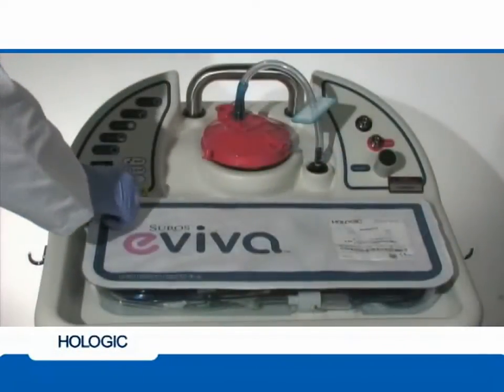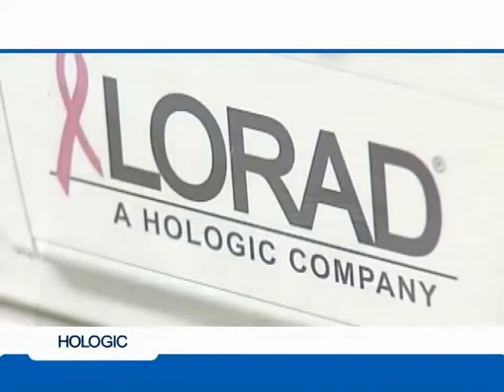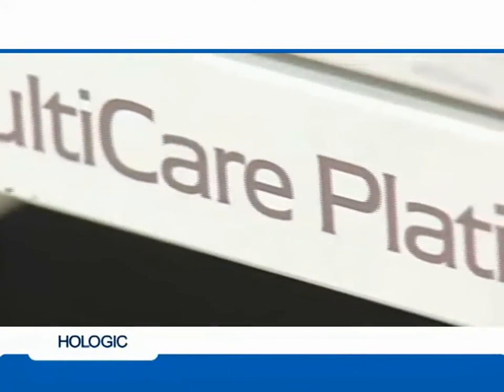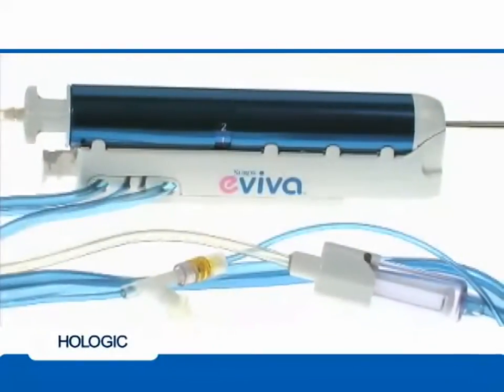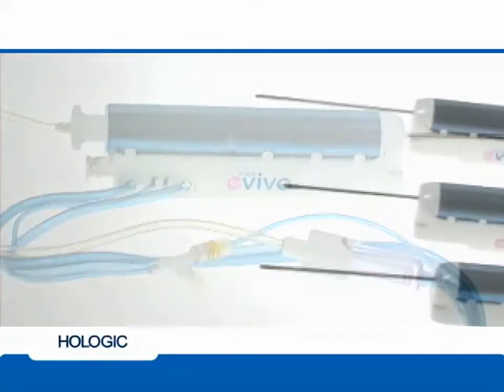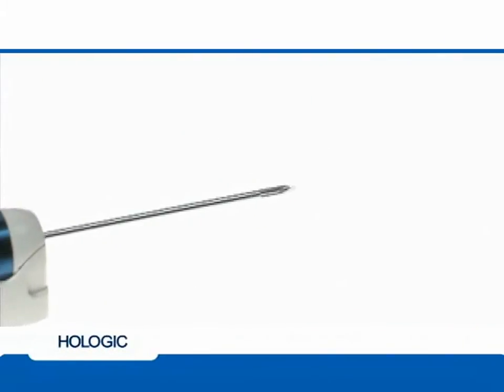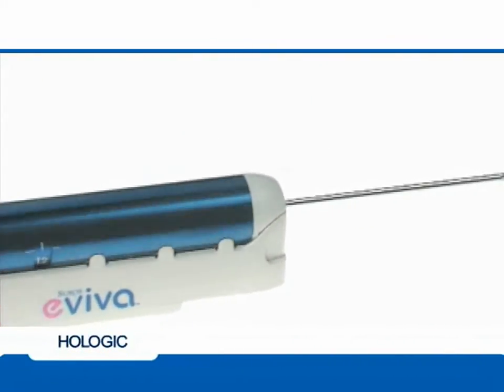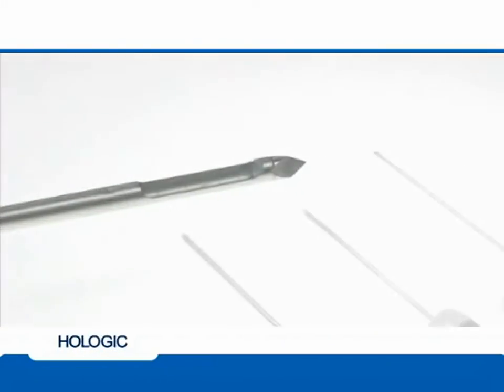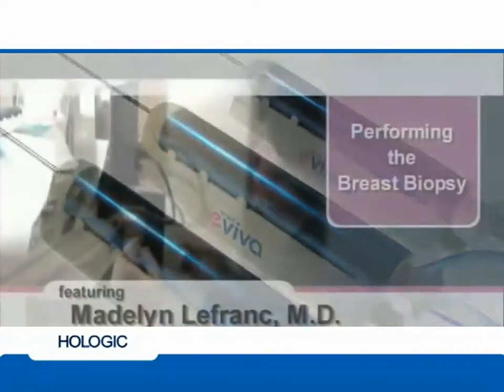In this presentation, we'll be featuring the ATEC Sapphire breast biopsy system with the Hologic Multicare Platinum Prone Stereotactic Biopsy Table with the Eviva breast biopsy device. Diverse needle options are available to address all of your patient's needs, regardless of lesion location or breast tissue. The Eviva family of products offers 9 and 12 gauge biopsy device options that are best suited for stereotactic breast biopsy, as well as petite options for thin breasts, allowing treatment of a broad patient spectrum.